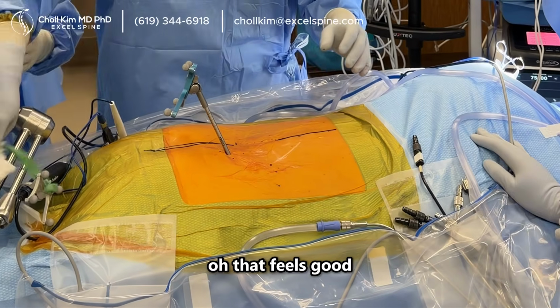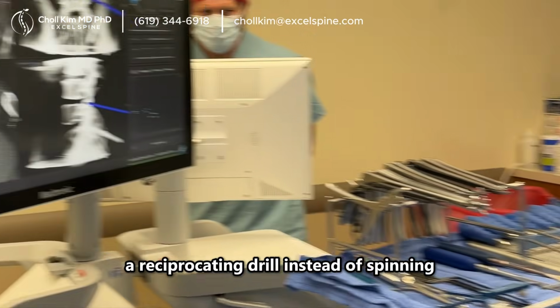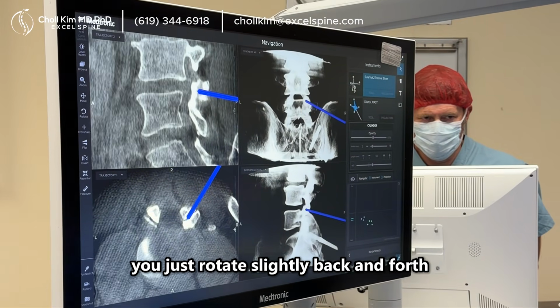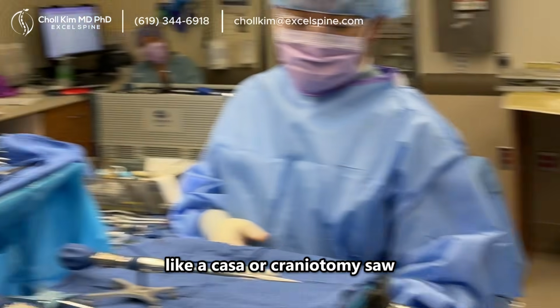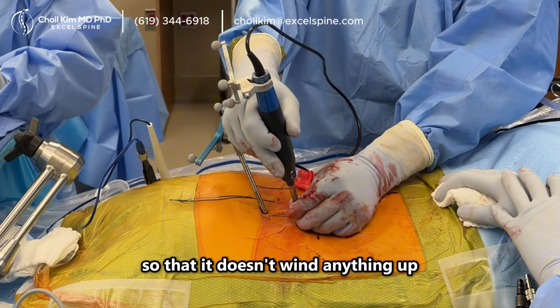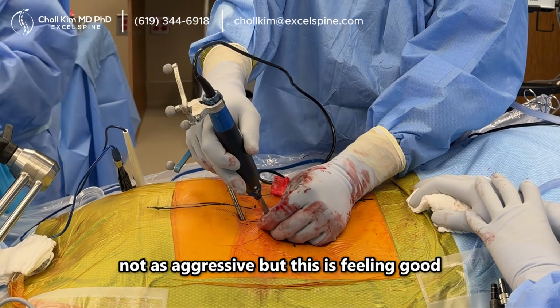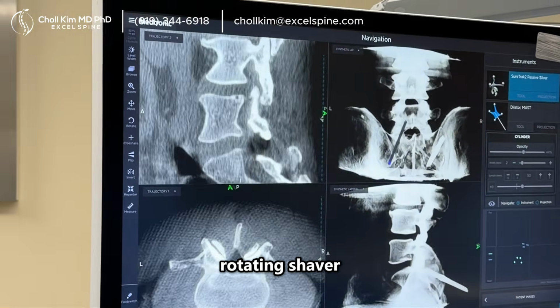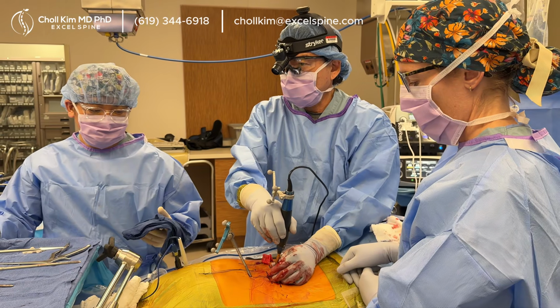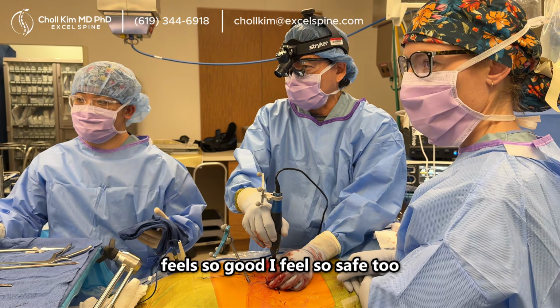Oh, that feels good. And there it is, DuraPro, a reciprocating drill. Instead of spinning, you just rotate slightly back and forth like a cast saw or a craniotomy saw so that it doesn't wind anything up. So that's safer. Not as aggressive, but this is feeling good. Rotating shaver. Feels so good. I feel so safe too.